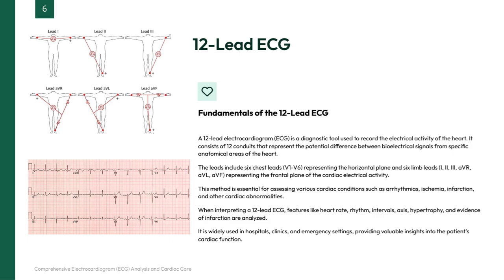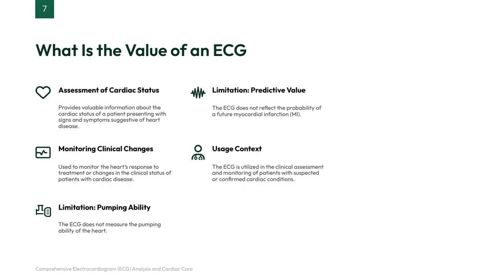It's a critical diagnostic method used not only in hospitals, but also in clinics and emergency situations to provide timely, life-saving information about cardiac health. Understanding how to interpret these features helps us make accurate and informed decisions for patient care. An ECG is incredibly valuable because it gives us important information about a patient's cardiac status, especially when they show signs or symptoms that might indicate heart disease. It helps us understand what's going on with the heart at that moment.